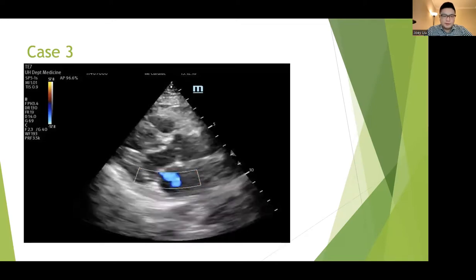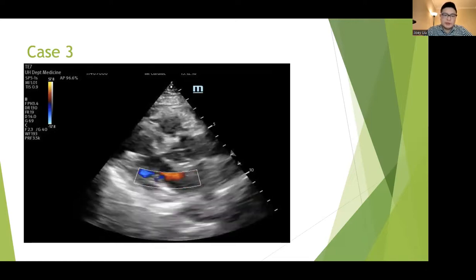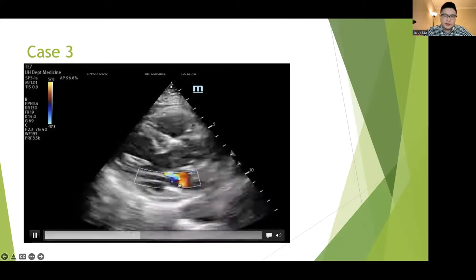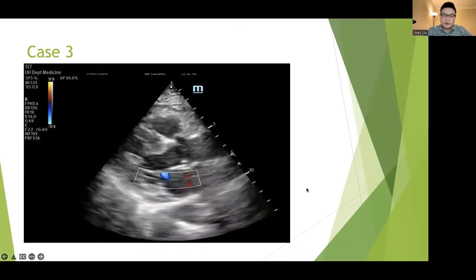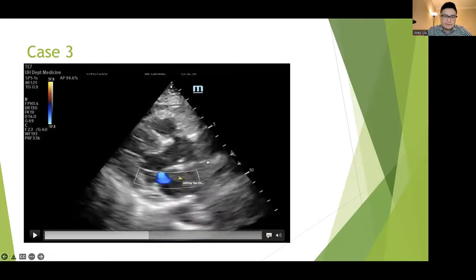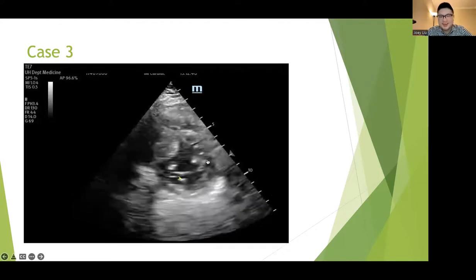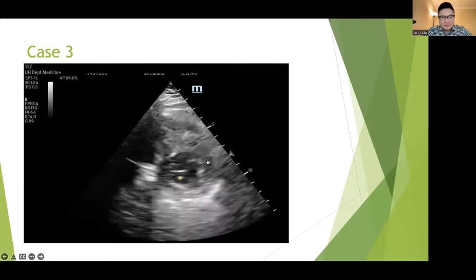Here, we do feel that there was maybe a presence of mitral regurgitation, as we thought there was an eccentric jet that comes through that could be representative of mitral regurgitation. Oh, you can add a little marker here. Okay, thank you, Dr. Yu.